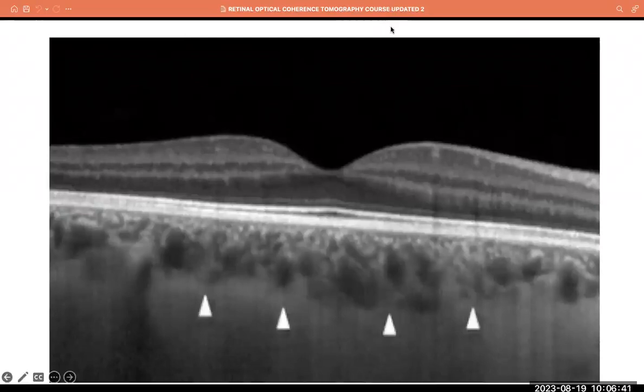So is there any other question? Yes, there are more questions. Dr. Adegbola Folake is asking what is the normal signal strength? There is no normal signal strength, but the thought is that your signal strength should be more than 50. If you're going to use that OCT for an analysis or for data collection for a dissertation, qualities less than 50% may not be acceptable.